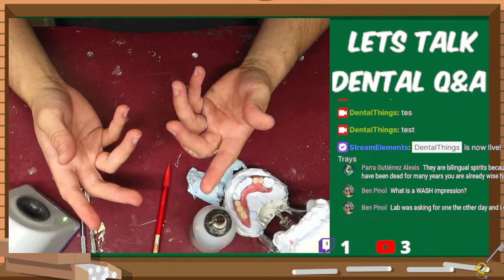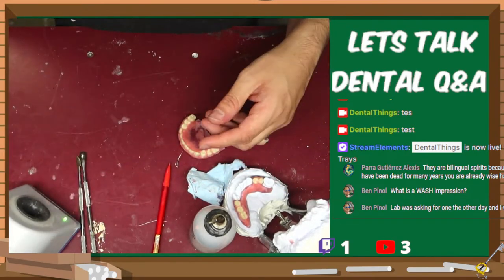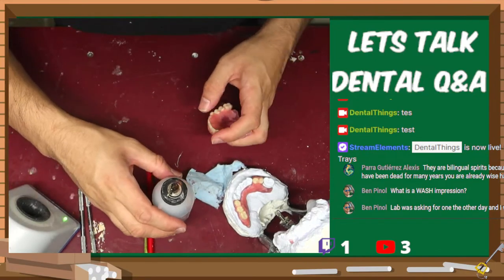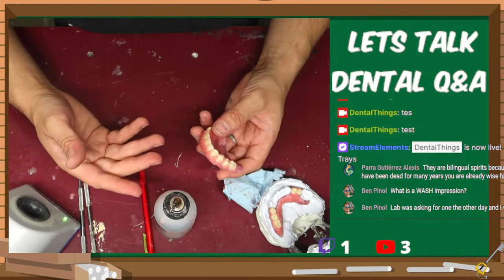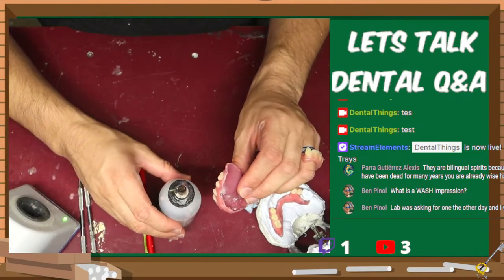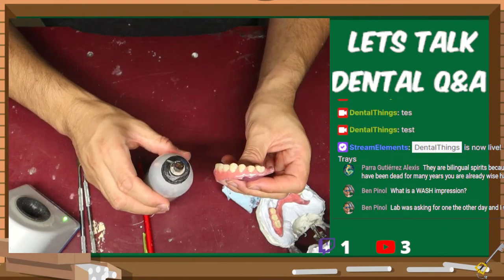What was the case? Was it just a crown prep, and they said, send us a wash impression so we can get better detail? But if it wasn't a crown case, if it's for a denture or something like that, usually we make all of our stuff off of an alginate most of the time.